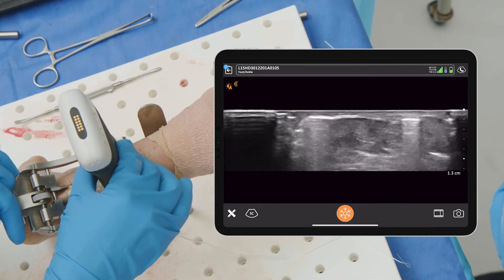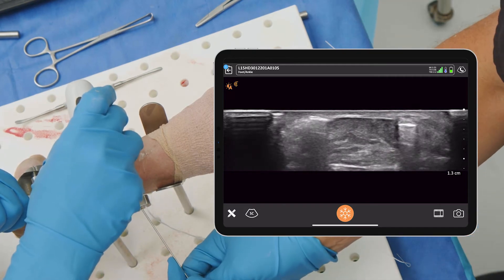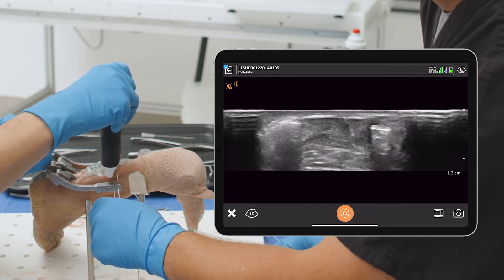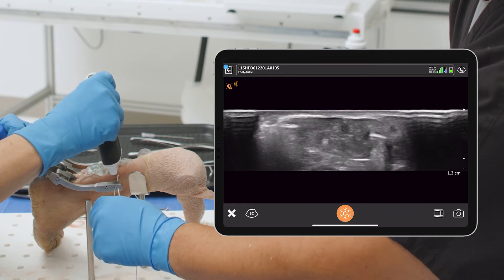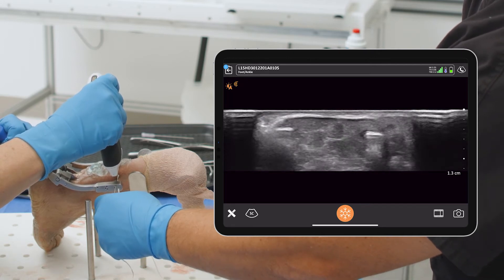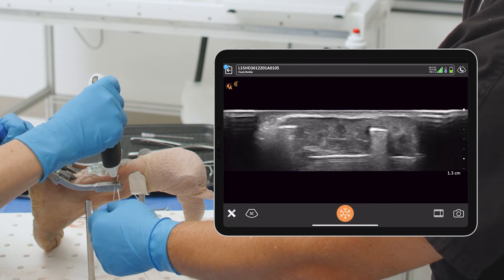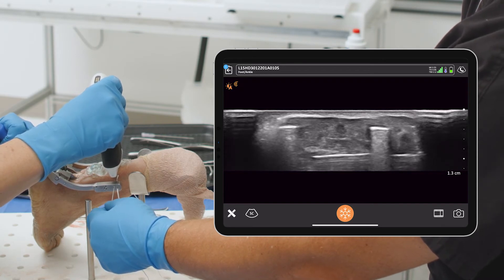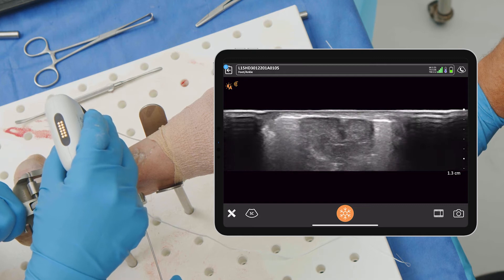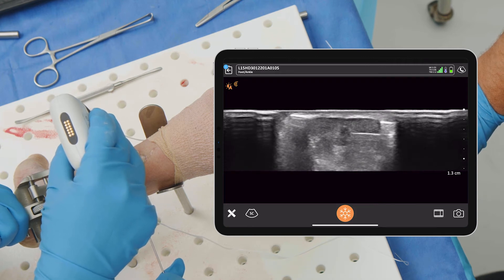Now I'm going to intentionally try to make you miss, Kelly — so if you screw up, it's not your fault this time. Bring it across slowly. There's our needle — jiggle it a little bit, push it through, and stop right there. You can see we are way too deep, so if we pass this suture you're not grabbing the tendon — this would be inappropriate. Pull it back. Now I'm going to reorient the jig. Go ahead and pass it through — stop — now we're through the middle. Now it's perfect.